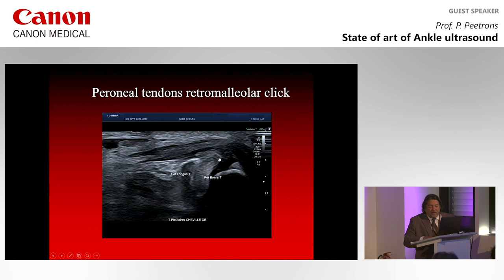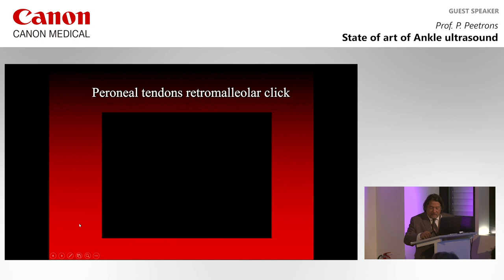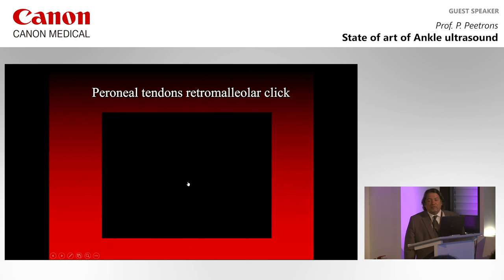You have the peroneus brevis and the peroneus longus tendon together, and what you'll see when the patient is asked to do the click is that the peroneus longus and peroneus brevis are turning around each other. So longus is there and brevis is there. And you can see it again. And she feels the click, and in your hand with the probe, you can feel a click also when the tendons are going to the other side, okay? This is the interperoneal dislocation. This is not so rare. You have to ask the patient to do this maneuver.